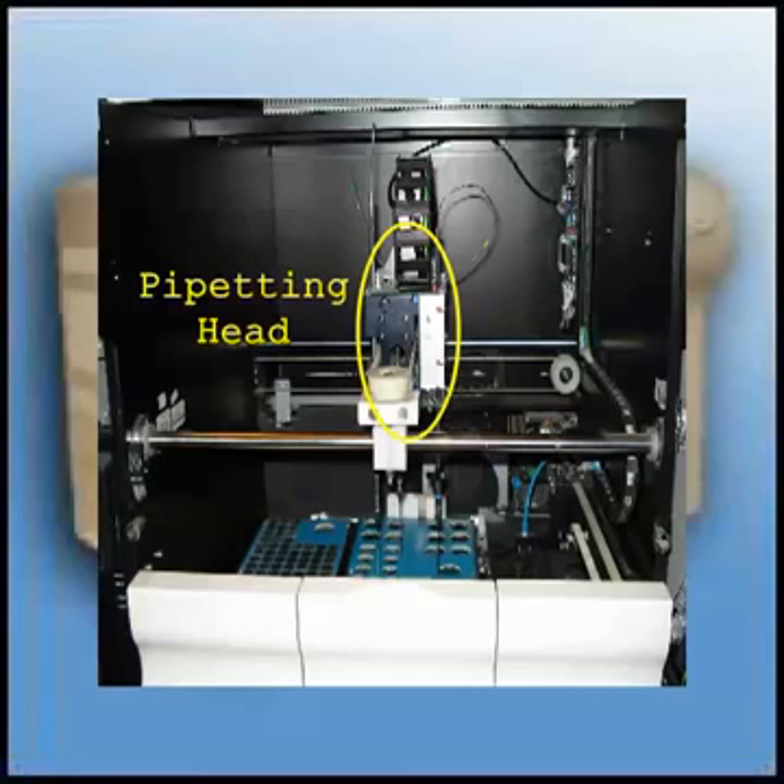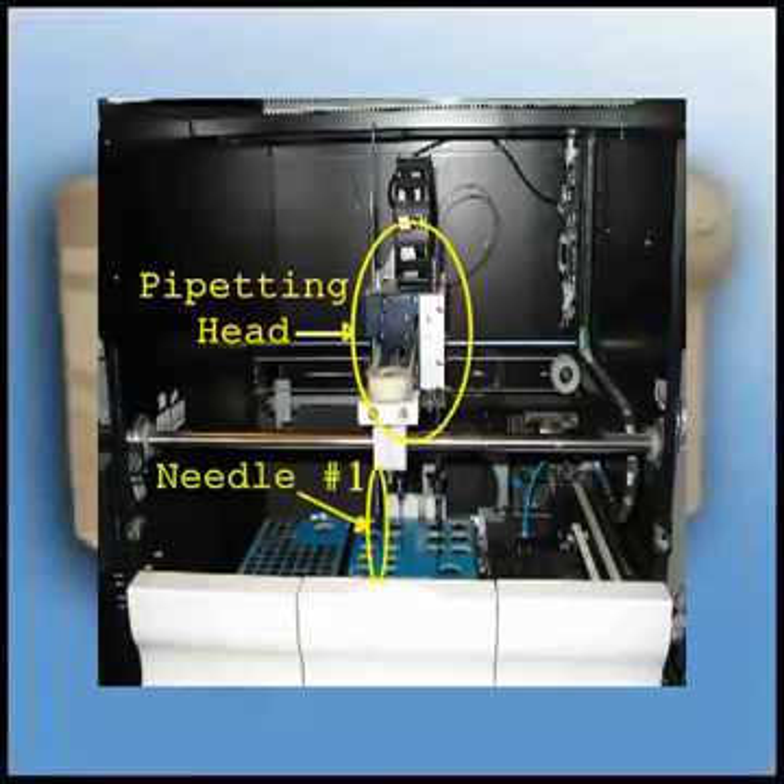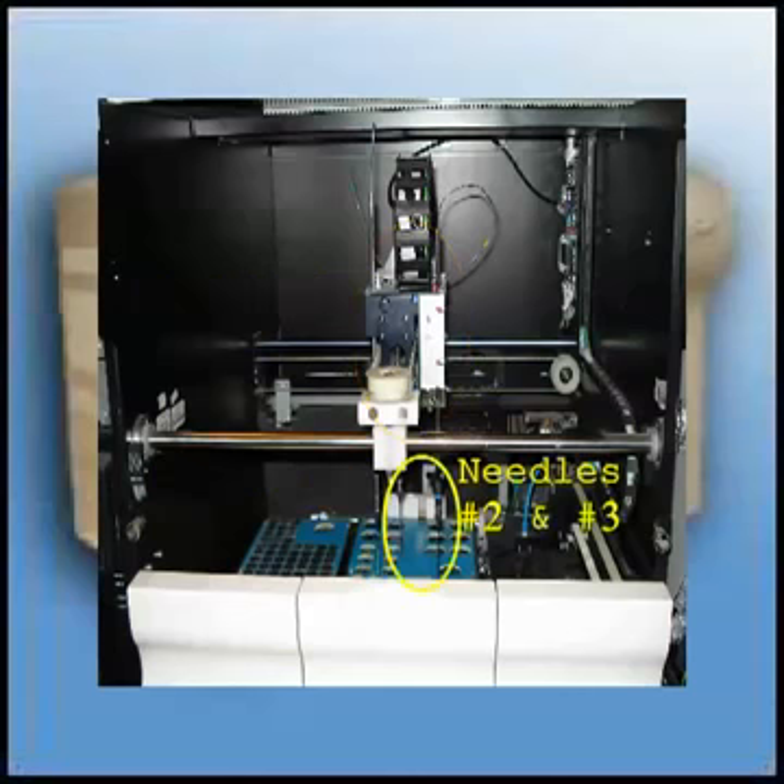By opening the front cover, you will have access to the three needles. Needle 1 picks up sample, quality control, calibrators, desorb, and Owren-Koller buffer only. Needles 2 and 3 pick up reagents.